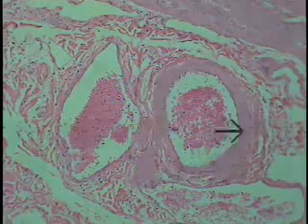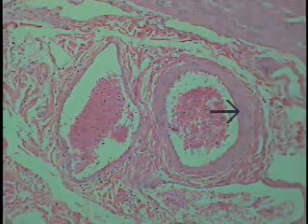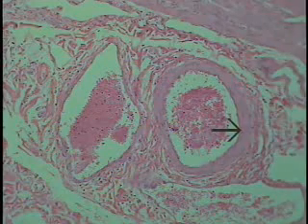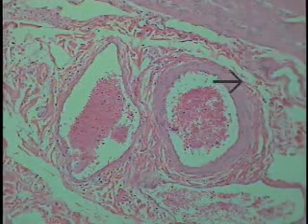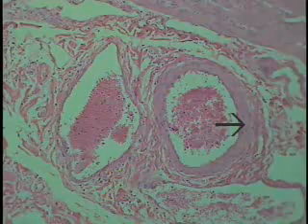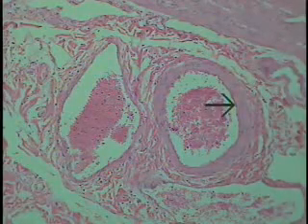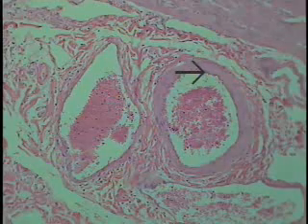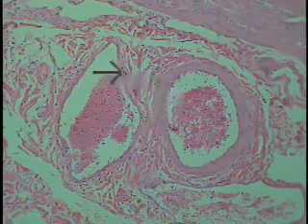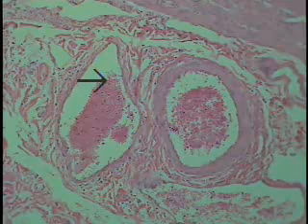The arrow indicates another example of a small artery within the gallbladder wall, and yet this one is of a smaller caliber than the previous one that we observed in the gallbladder. Again, the predominant feature that attracts one's attention is this round donut or bagel type of configuration, and the predominance visually of the tunica media made up of smooth muscle. Even at this scanning magnification, one can make out the internal elastic laminae that was demonstrated on the previous illustration. In this particular case, it also has a companion vein associated with it.